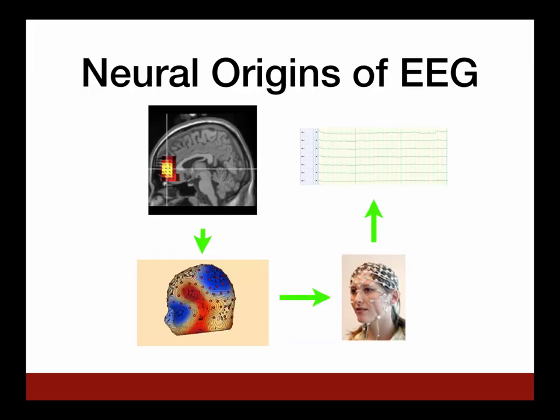For anyone who might not be aware, the belief is that EEG is generated in pyramid cells in the brain, and we call these bundles of cells all activating or firing together dipoles. Dipoles then get represented across the human scalp like this, and we can measure the electrical fields on the scalp using electrodes. Here we have a 128-channel EEG net, which is very similar to our setup here at NIH. And using these electrodes, we can monitor your brain waves sort of in real time.